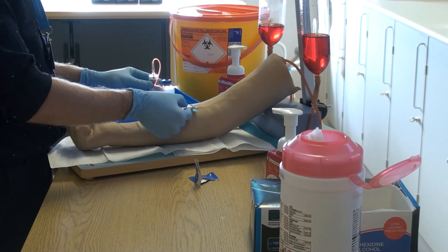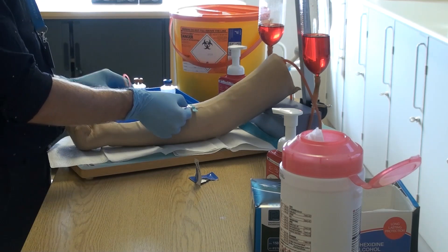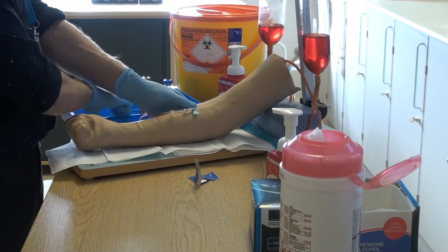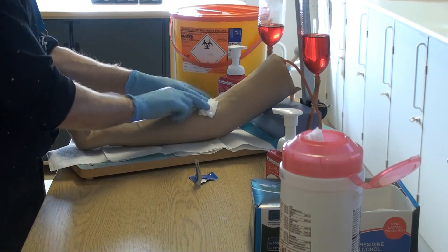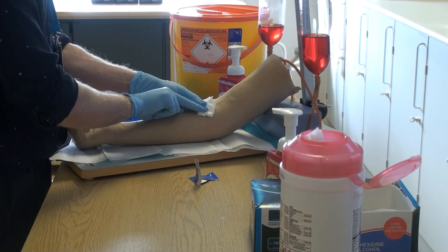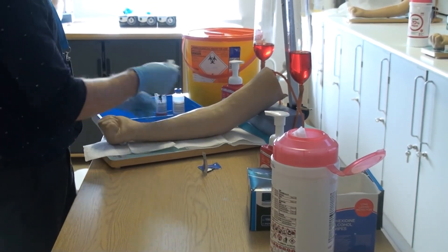Notice that the right hand stays firmly on the needle at all times. Once the sample is finished, engage the safety device on the needle until it clicks and apply gauze over the site. Dispose of sharps into the appropriate sharps bin and apply light nail pressure to the site to encourage healing and prevent bruising.